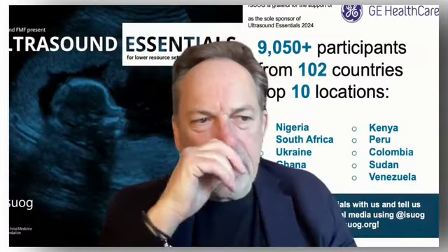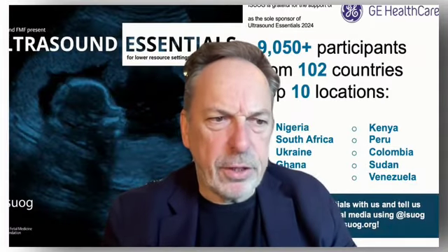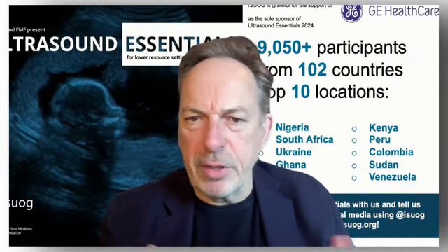But if the patient is symptomatic, probably I can advise to use the sonohysterography. So I think that's something we'll no doubt hear further from Thierry in the talks about the endometrium, using saline and so forth.